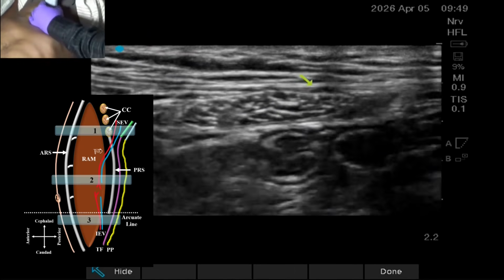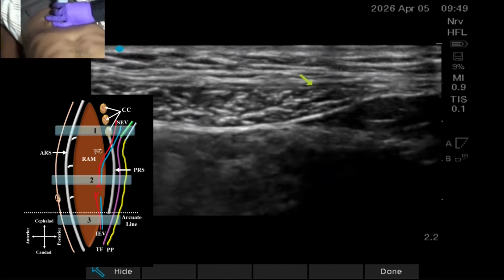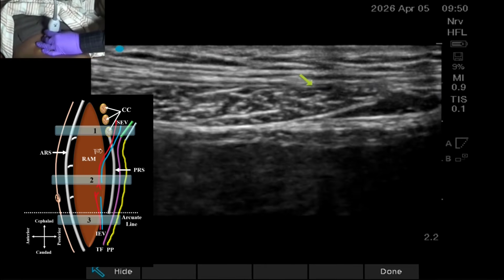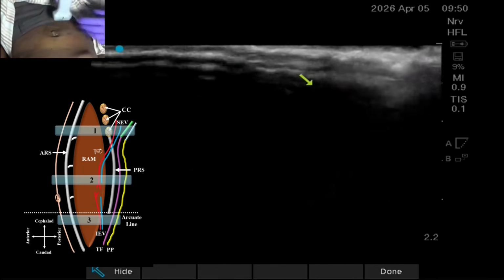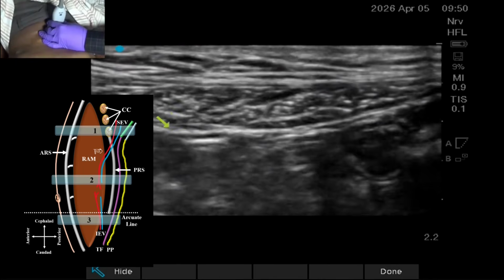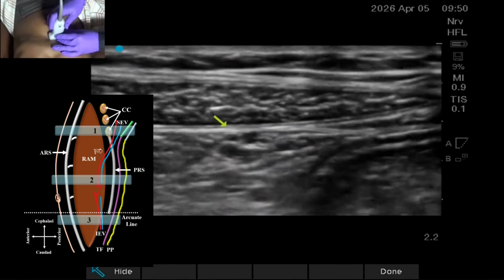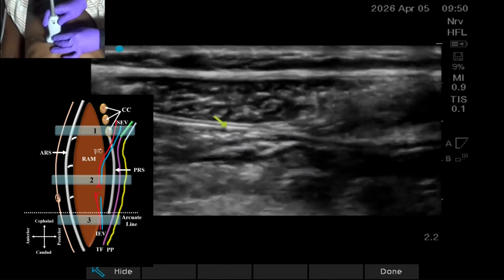You can see it nicely. Then if I go down from the umbilicus to the symphysis pubis, if we divide it into the upper third and lower two thirds, from that area you will not have a posterior rectus sheath. The double line you will not see. So for the rectus sheath block, can you see the blood vessel I just saw? Here. Which vessel? Yes, very good. Inferior epigastric vessels. Superior epigastric vessels we may also find. I'm not going to waste time searching for the vessel, we'll just have a sweep and you'll get a little bit above.